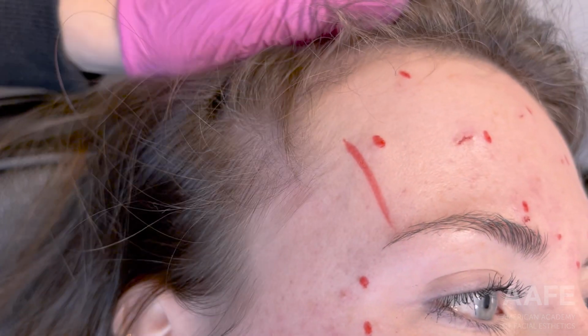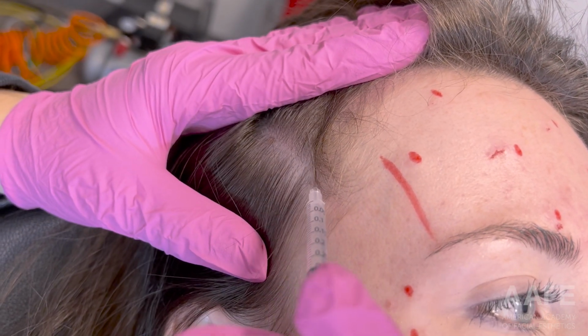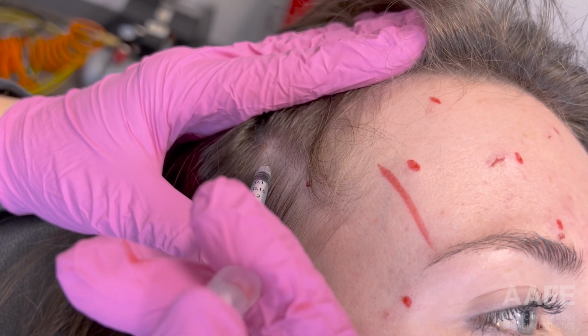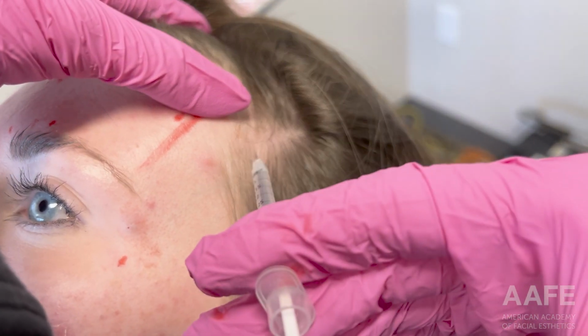Moving up to temporalis, hers is very, very strong. The video does not even do it justice, but she is very strong. I cleaned right before injection and I'm injecting up and away in 2 different sites. You can inject anterior, medial, posterior, wherever the patient needs. And you can see there when she clenches, you can see it really, really activate.